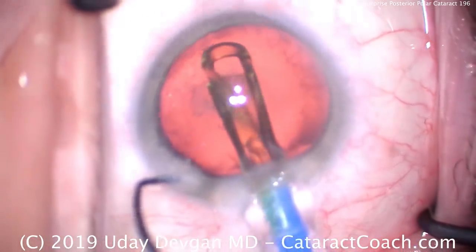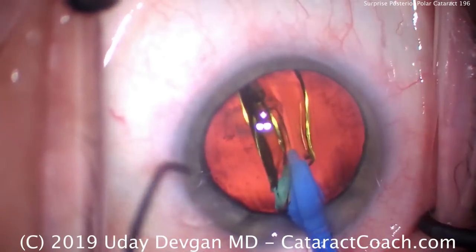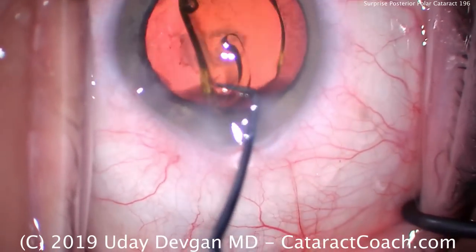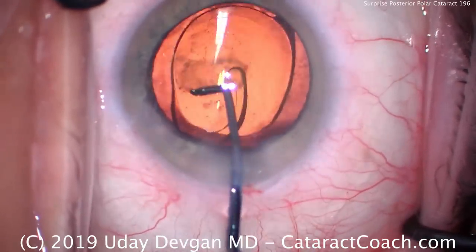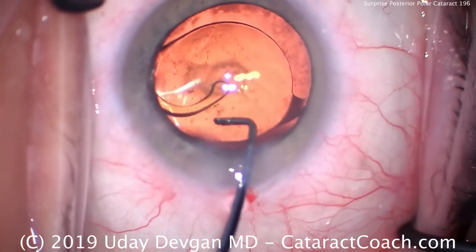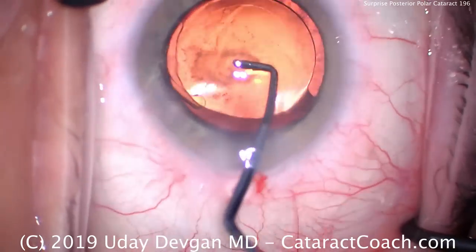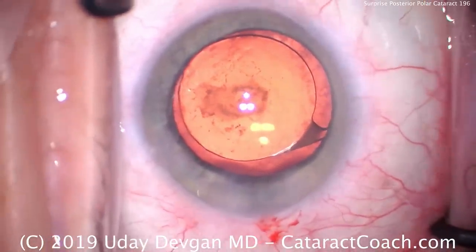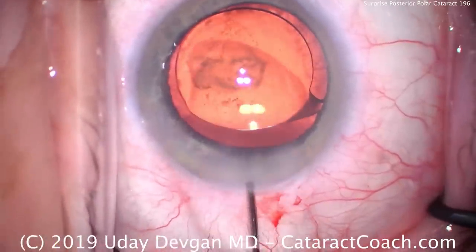So putting this lens in — notice I don't aim it towards the posterior capsule; I want it to go just under that nasal anterior capsule rim. Now using the chopper, we'll get it in appropriate position. Again, don't want to touch the posterior capsule. Gently rotate this around. There's a nice wad of viscoelastic between the optic and the posterior capsule. You are wondering: what about that big central opacity? Isn't the patient going to have impaired vision tomorrow? Yes, in fact, they will.